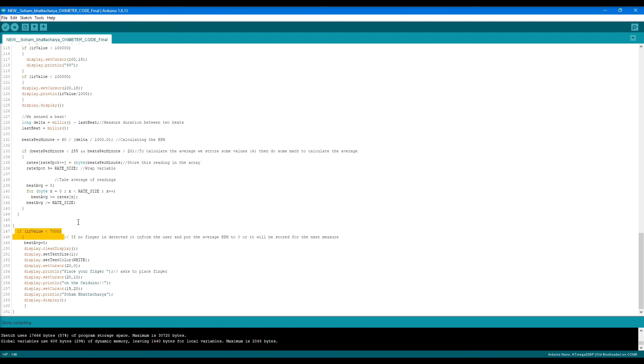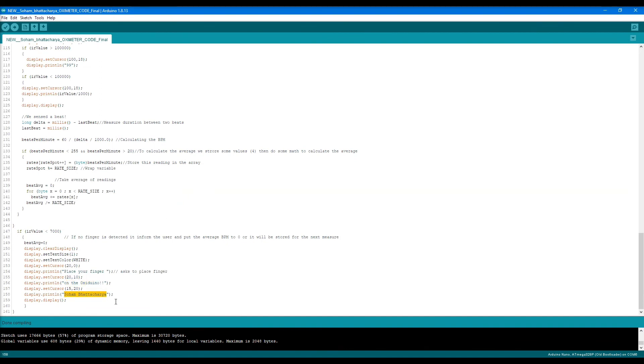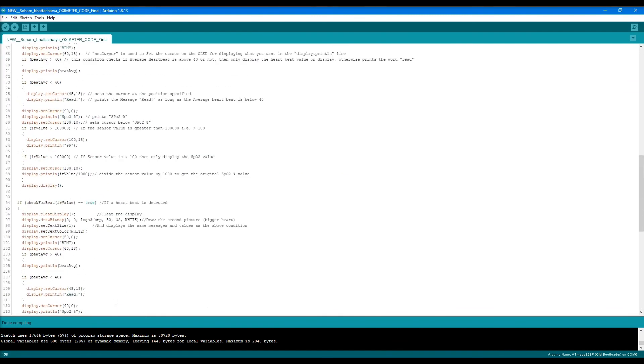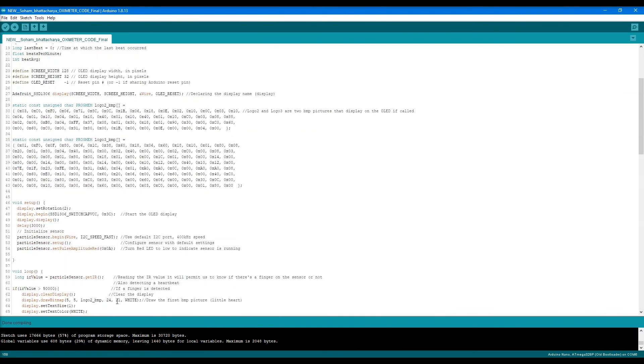From line 147, we see that if the IR value is less than 7,000, this means no finger is being placed, so it displays the 'place your finger' message on the second line. My name is also on the third line.